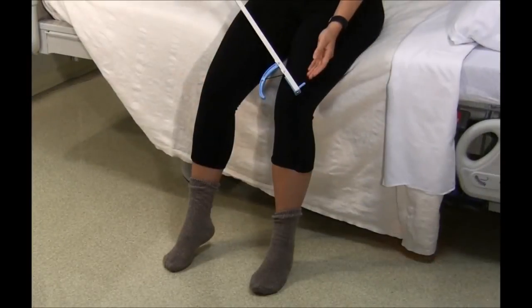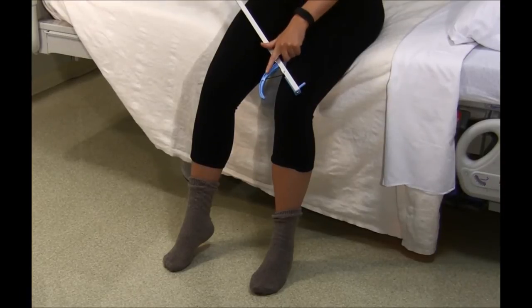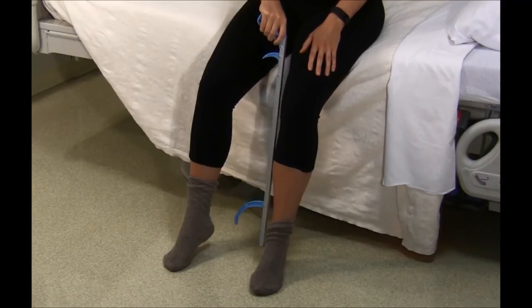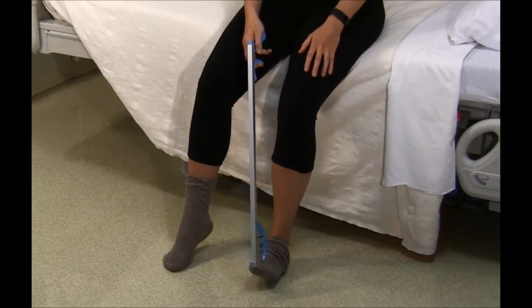To take off your socks, you will use your reacher. You can either use the nub on the top of your reacher, or you can use the movable arm to remove your socks. If you choose to use the nub at the top of the reacher, place the nub at the top of the sock and push it over your heel. Do not push the sock all the way off. When able to, use the reacher to pinch the front of the sock and pull it off of your foot.